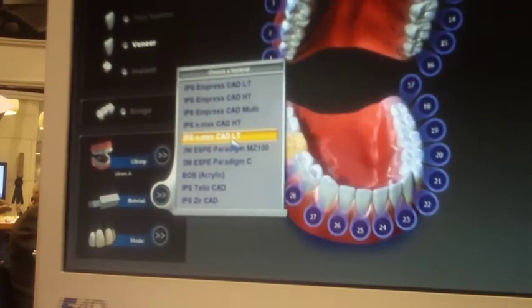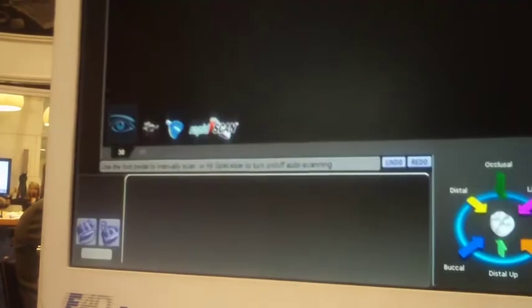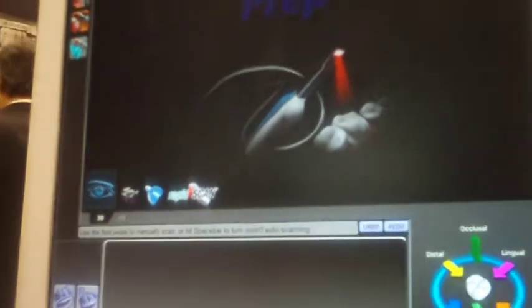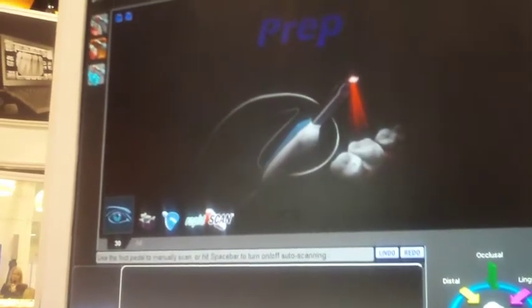So let's just pick Empress because that would be pretty standard, and then you pick your shade. Then we go into our scanning tab. There are two ways to scan: either with the foot pedal or with the rapid scan, and I'm going to use the rapid scan.